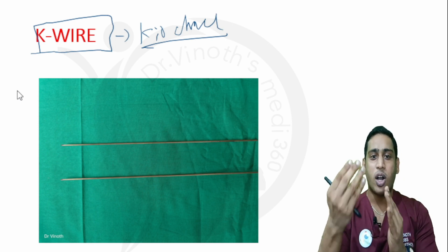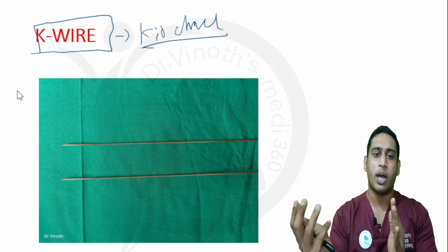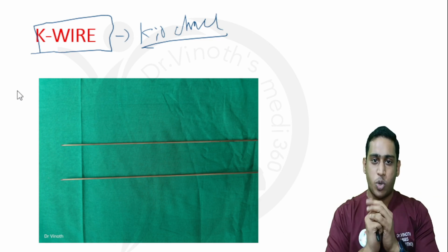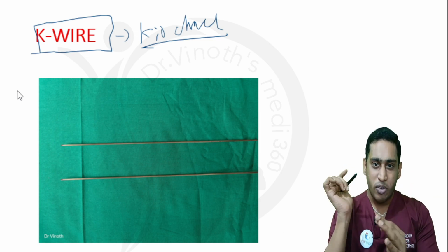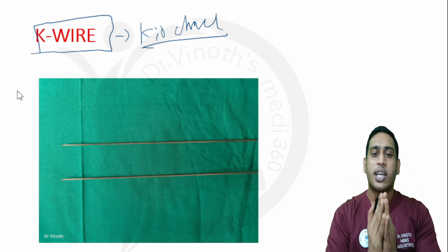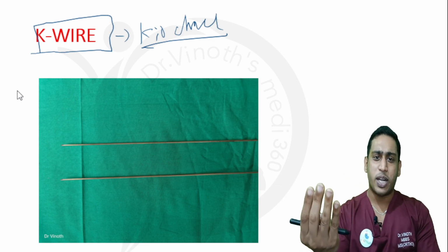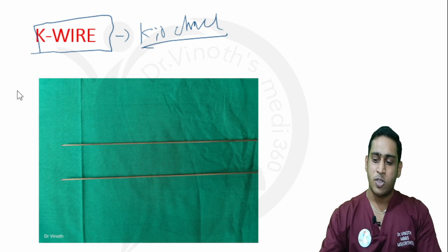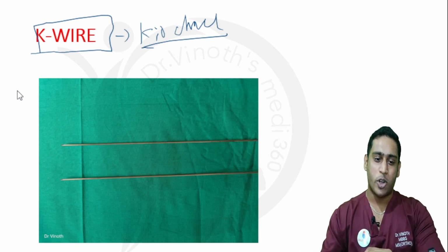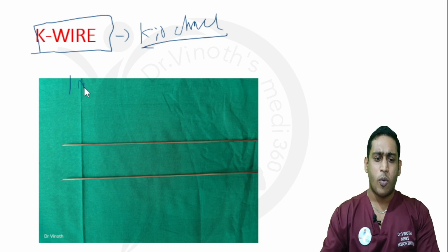Even if we are not fixing the bone with the K wire, they are used intraoperatively, either for drilling the screw hole or for temporary fixation of any fractures. We require K wire irrespective of the mode of treatment. So K wires are part and parcel of any surgery in orthopedics. You should know everything about K wire. They are available from 1 millimeter through 3 millimeters, or even more than that.